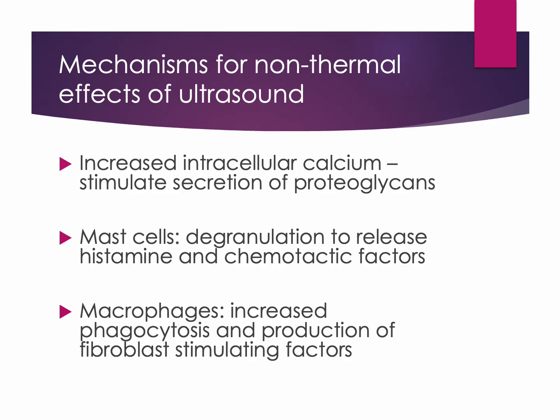the early inflammatory phase. Macrophage activity may also be enhanced with non-thermal ultrasound. Macrophages are critical cleanup and signaling cells within the healing process. Ultrasound has been associated with increased phagocytosis, meaning macrophages may become more effective at removing damaged tissue and cellular debris from the injured area. In addition, macrophages can increase production of fibroblast stimulating factors, which help recruit and activate fibroblasts.